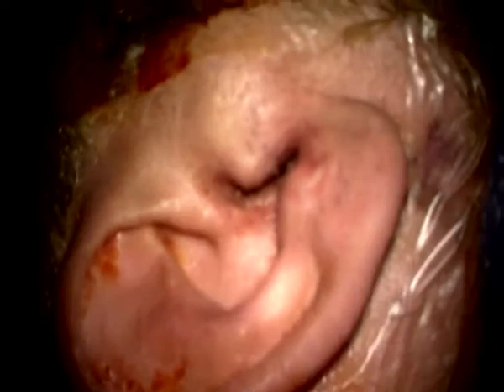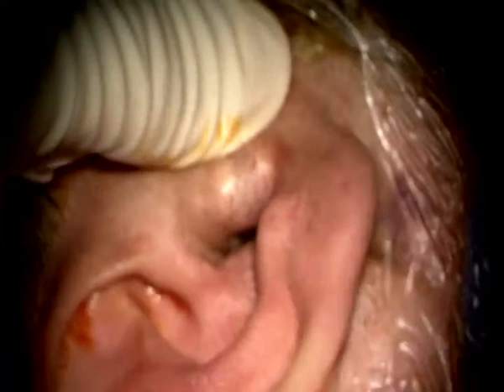So take the microscope, please. Push the microscope in. I want to take out the graft from the tragus area, and I want to place the stitch, the Torbici stitch. This is basically the only part that I do with the microscope. I just find it a lot easier. See, I injected here a lot of stuff. Give me a sponge, please. I think by mistake, I didn't mean to have all that infiltration anteriorly, but anyway.